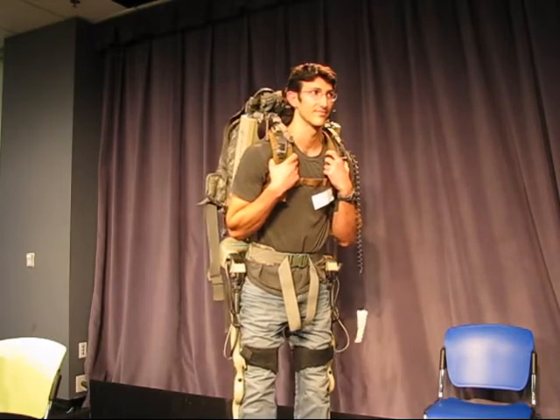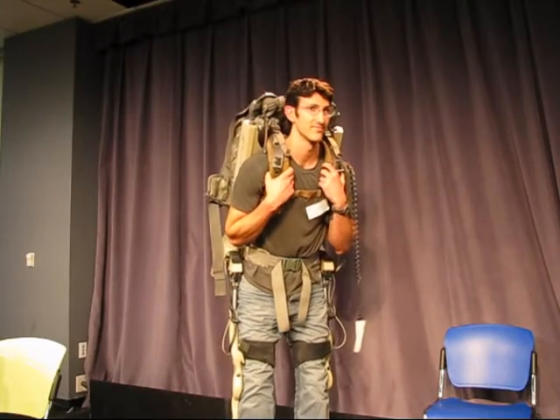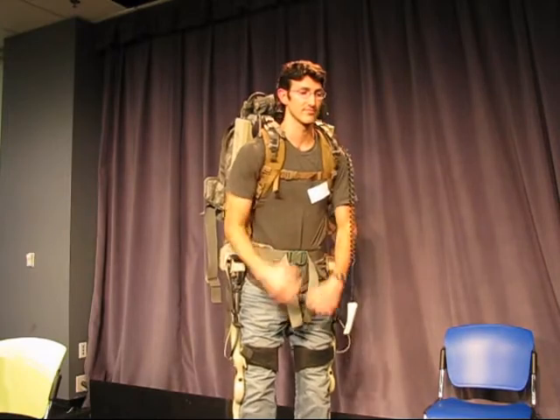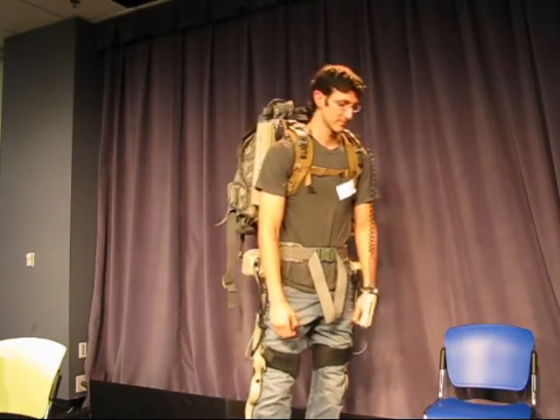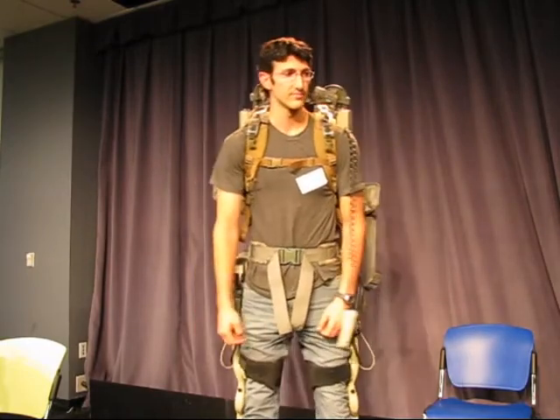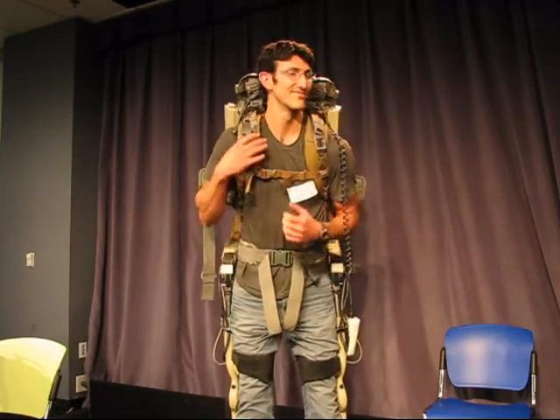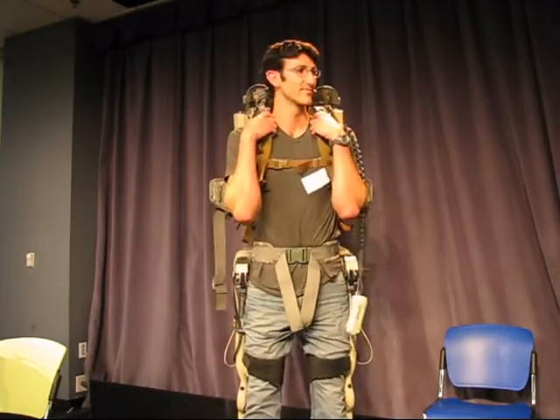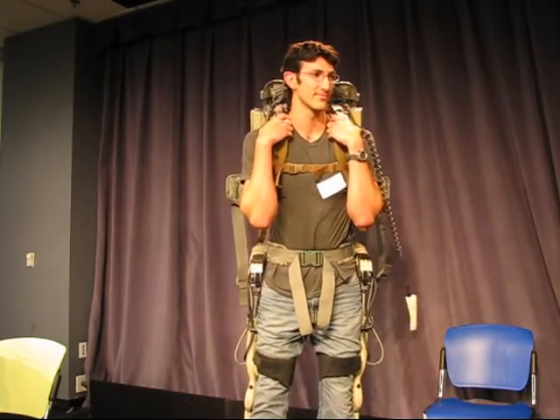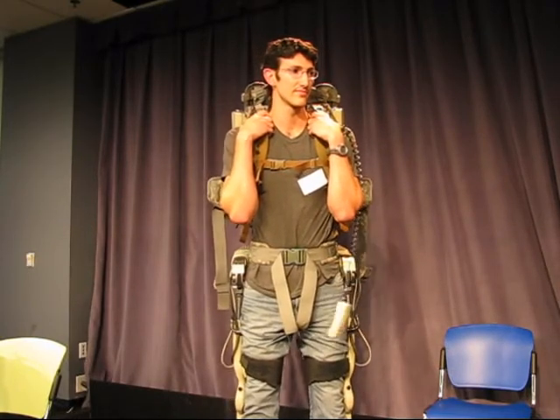How much training does it take to use one of these things? Great question. About 3 to 4 days. What we found is that as we've added more and more power to the exoskeleton, the training curve goes up. The ideal training situation is have someone get in it for the first time for about 15 minutes on the first day and then get out of it and sleep on it. And I'm honest, you go and you sleep on it and your brain replays those activities of the day and you learn it overnight. And then you have to get used to how the machine's going to work with you and how to manage that inertia when you don't feel it. That's really the training group.